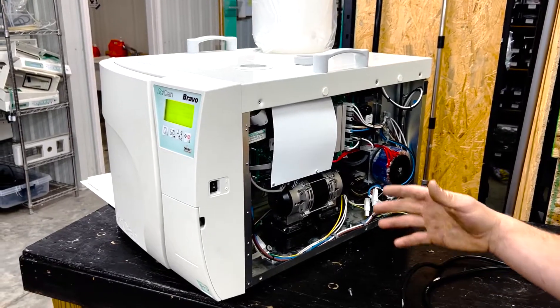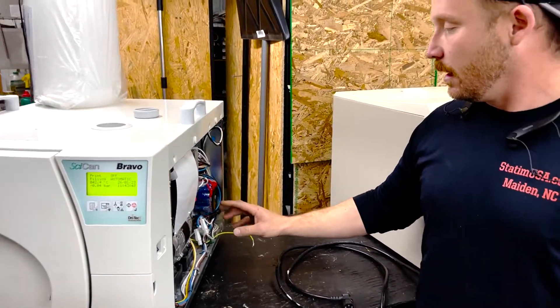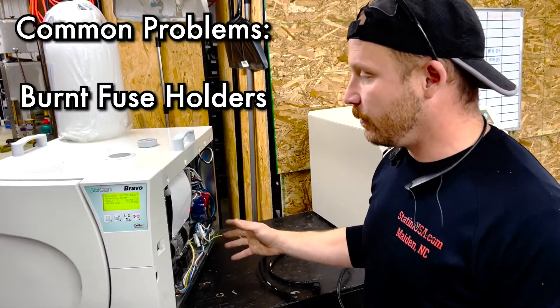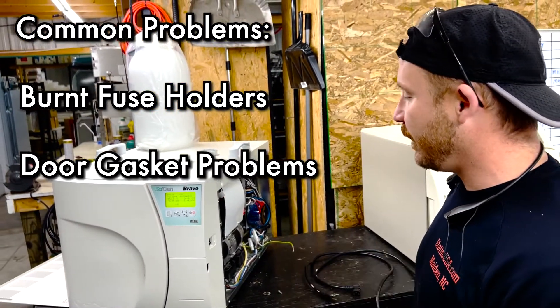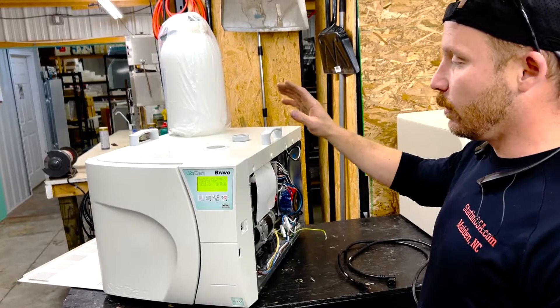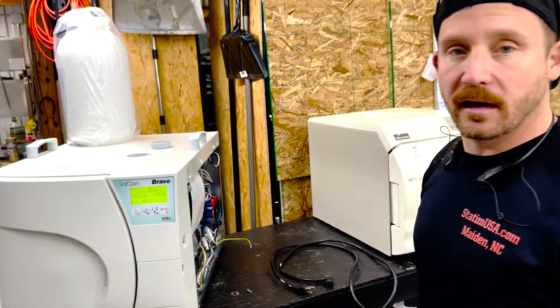The only other problem that we see with these things consistently is the fuse holders will burn and go bad — that's a problem we see a lot. The door gaskets obviously prevent it from pulling a proper vacuum. We sell these brand new, we sell them refurbished, and we will repair them. If you have any questions, give our tech support line a call.